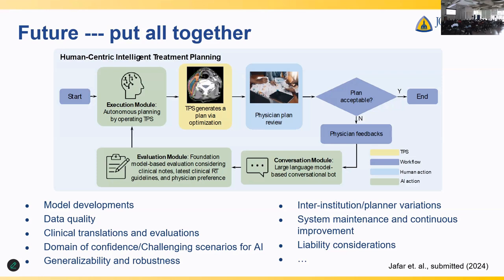So first, the generalizability. With respect to machines, that's easily done because we have the treatment planning system in the loop, and that software already considered all the machines as long as we commission the TPS to the machine. So that's easily taken care of. Between different body organs, that's quite a challenge. For example, the robot that we train for prostate doesn't work for planning the head and neck. We have tried that. So I think the next step is to generate some robots that can master all the tumor sites altogether, just like a human dosimetrist who is trained to learn the planning not only for a specific site.